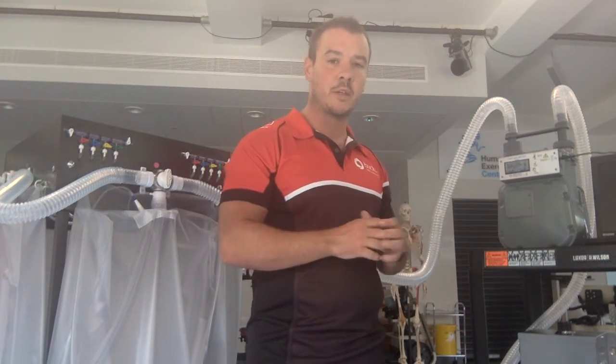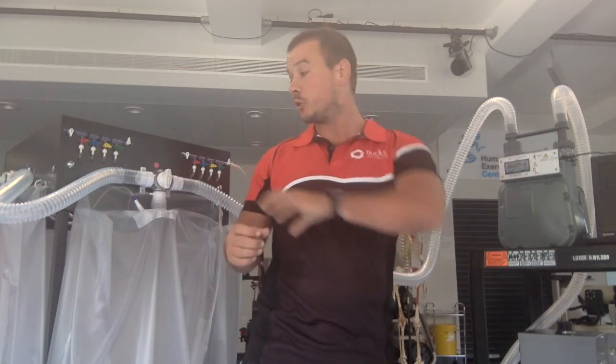It's important that you make a note of this before you shut the Douglas bag and turn the vacuum pump off, because when you shut the Douglas bag, more air will be drawn out and that number will increase.